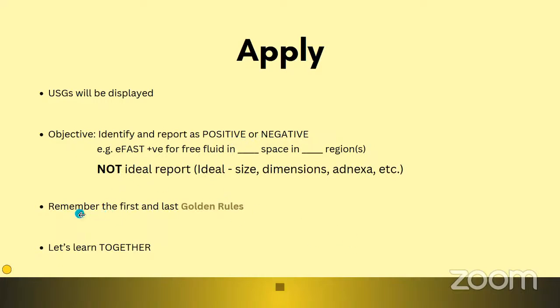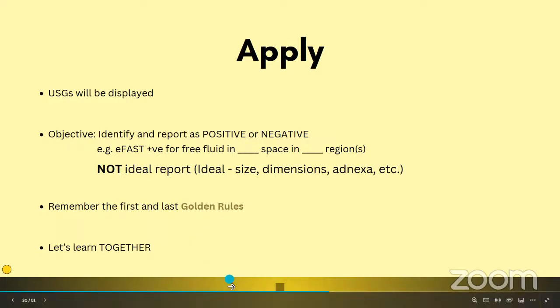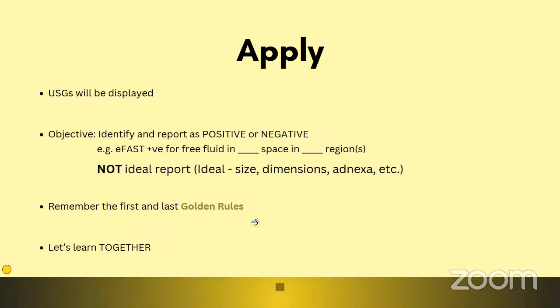Okay, third one. We must remember all the golden rules, especially the first and the last one, which if you could recall, right? So could anyone type out what are the golden rules? The first and last golden rule?